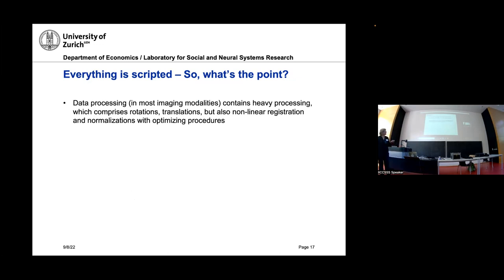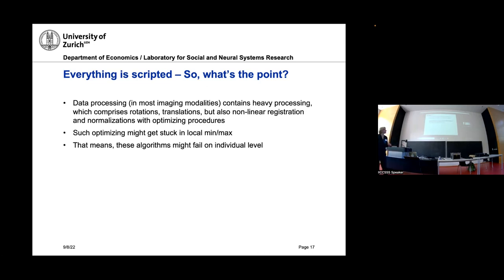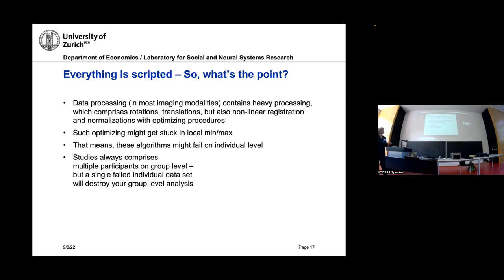So I try to convince you that in the background of all these toolboxes, rather heavy things are going on, and these algorithms might fail. They're using optimization procedures. There are local minima, maxima, they get stuck in them. And they might fail on an individual level.